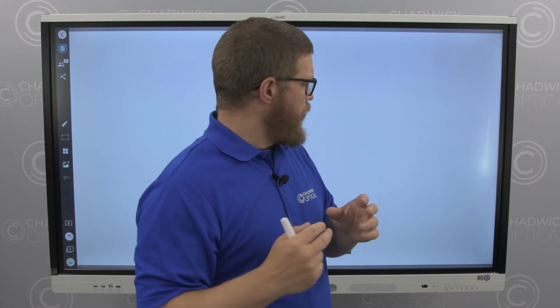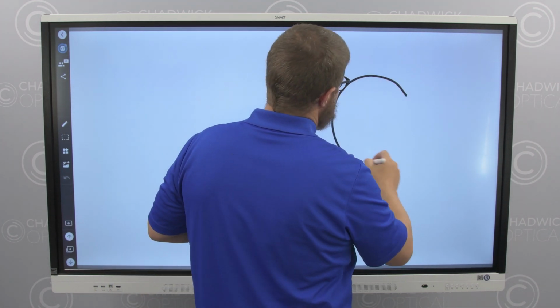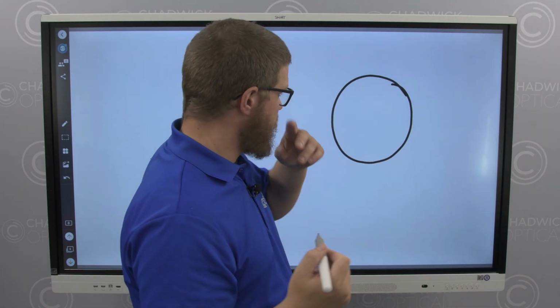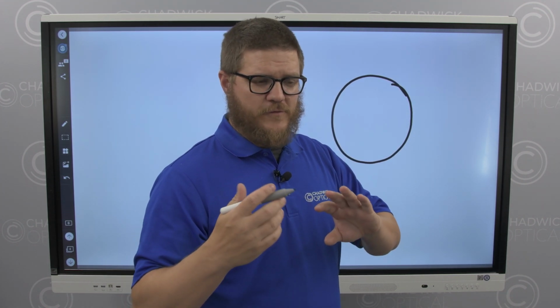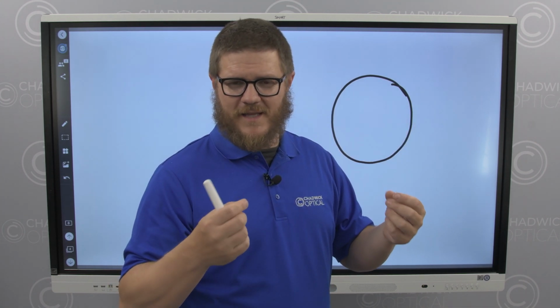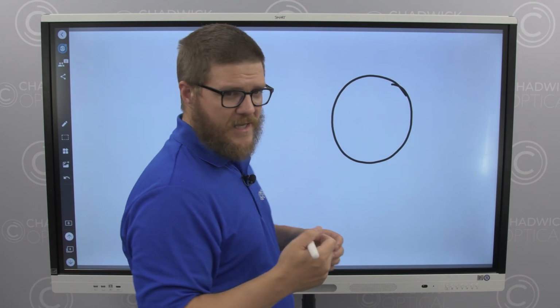The other thing about the frame selection, and we talked about the frame shape selection, but there's also the frame design. There's a couple of types of frames that, if you order them, we need to manufacture the lenses thicker and the glasses just don't come out looking quite as good. One of them is nylon rimless.